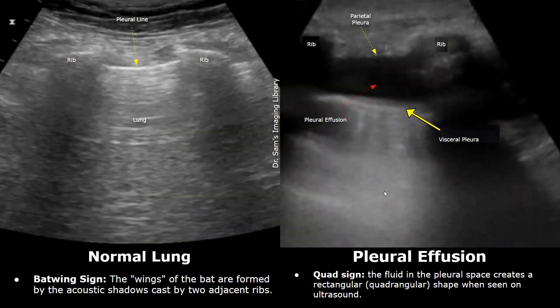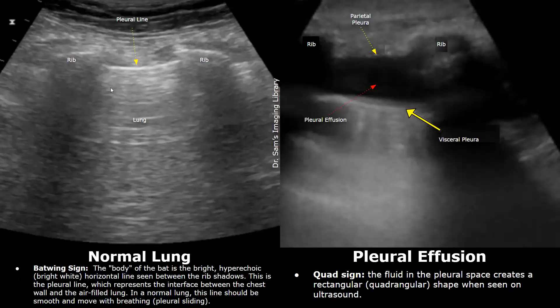This is the appearance of a normal lung seen between the ribs. The normal lung has a bat wing sign — the wings of the bat are formed by the rib shadows. These are the ribs and these are their acoustic shadows; the lung is present between these two ribs. This bright horizontal line is the pleural line, seen between the ribs. It is considered the body of the bat, representing the interface between the chest wall and the air-filled lung.